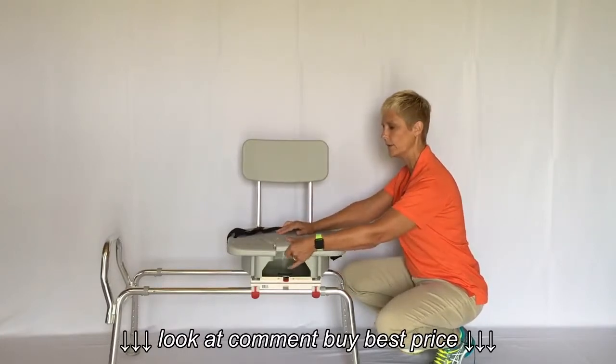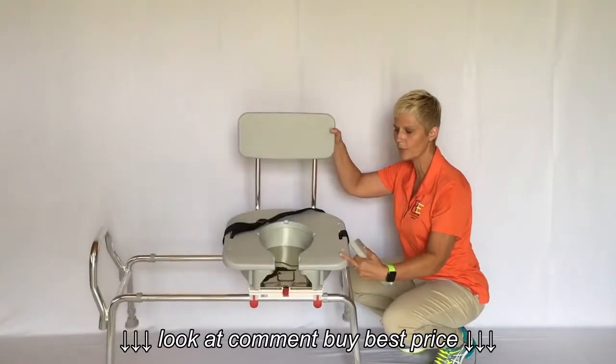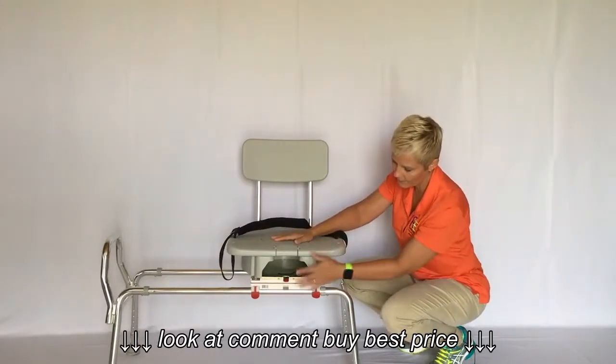The seat also has a cutout in the middle, which assists with personal hygiene. It also has a safety belt that attaches with Velcro, and then it has three levers in the front.